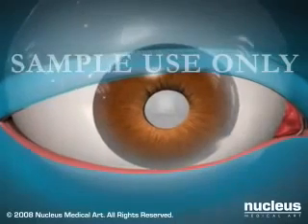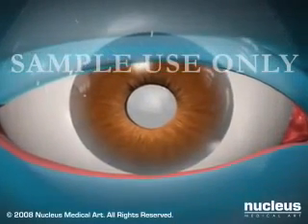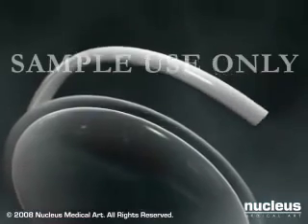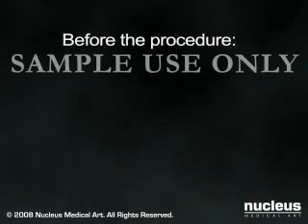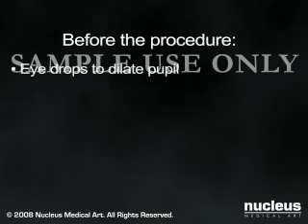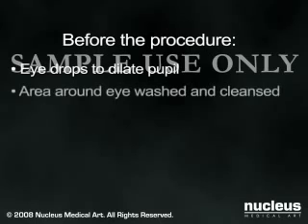Cataract surgery is the removal of the affected lens from the eye and the insertion of an artificial lens. Before your surgery, you will be given eye drops to dilate your pupil, and the area around your eye will be washed and cleansed.